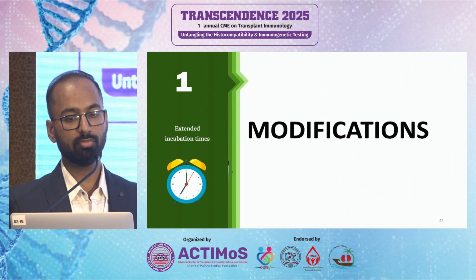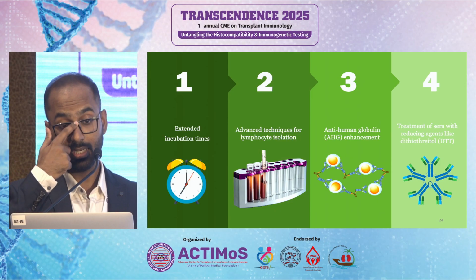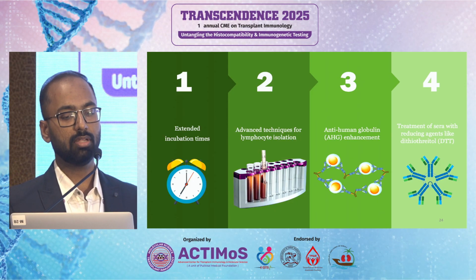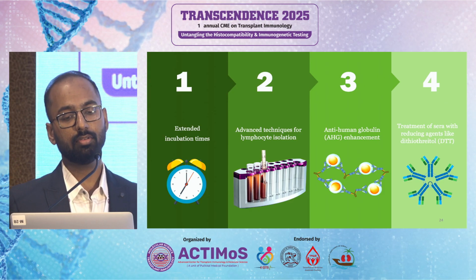And we have a few modifications. We extend the incubation time, thereby increasing sensitivity. So normally, if we have a 30 minute incubation, we will incubate for 1 hour, and if it is 1 hour, we will incubate for 2 hours. That is how we increase the sensitivity.